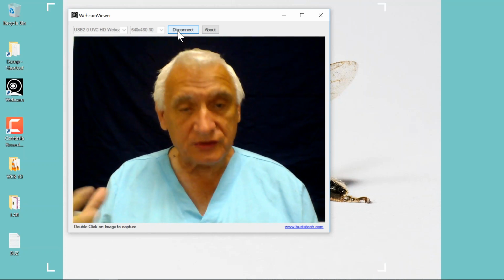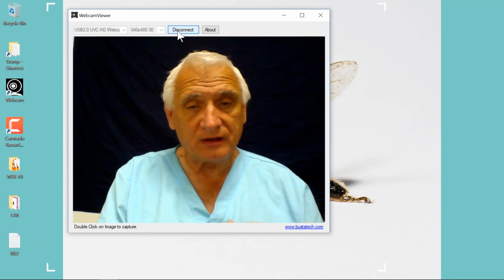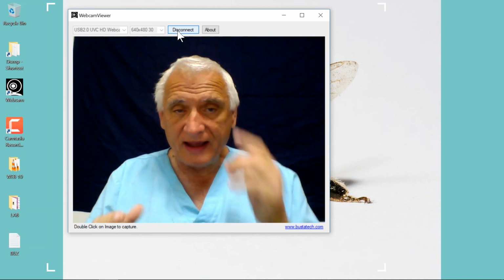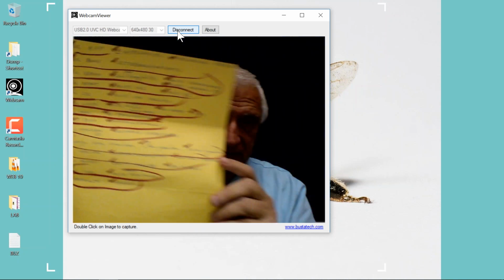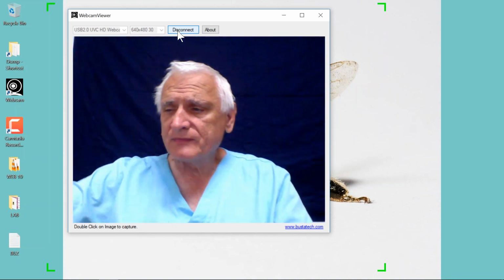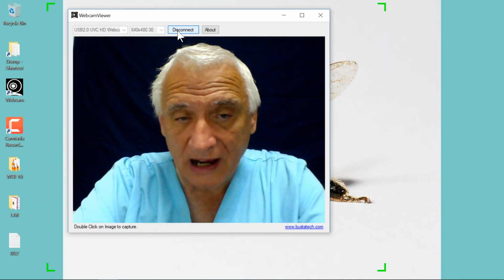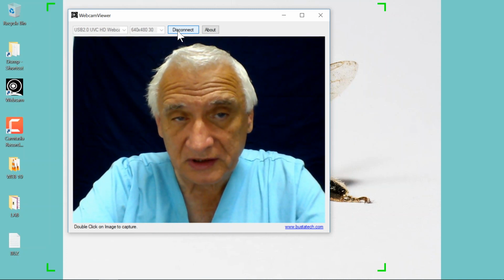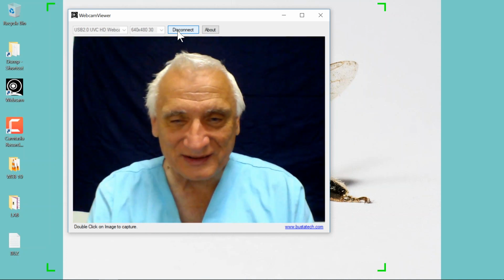So rather than having a microscope lab for every webinar, I saved up a bunch of them. Today I picked out about maybe 25 or so slides, and we're going to be looking at slides in the lab. We're not going to be looking at PowerPoint slides. We'll be looking at real glass slides, super high quality digital files.